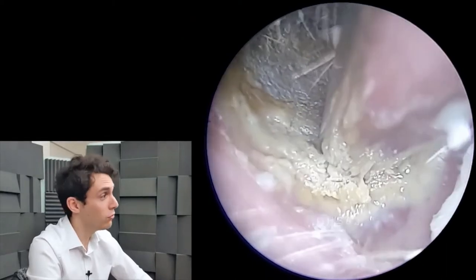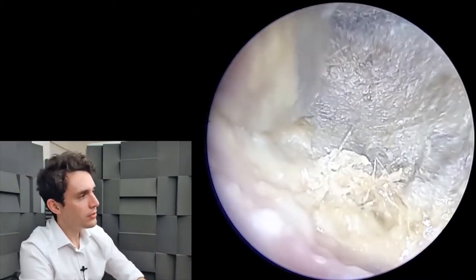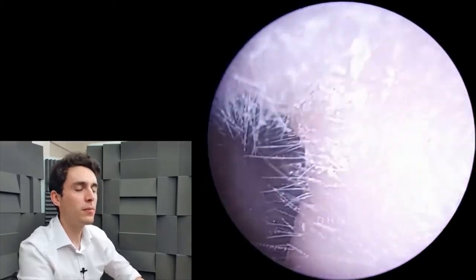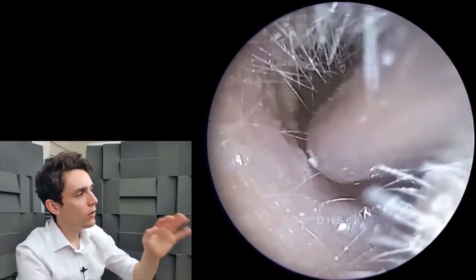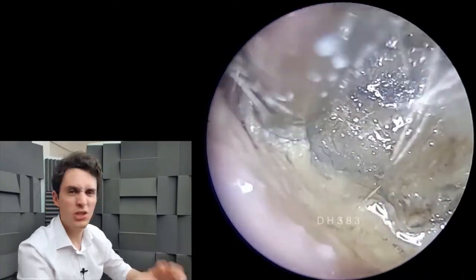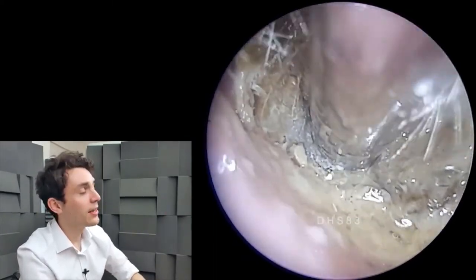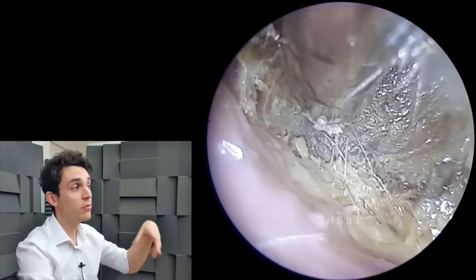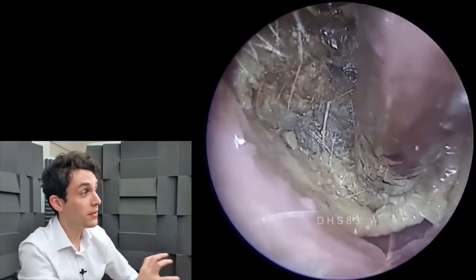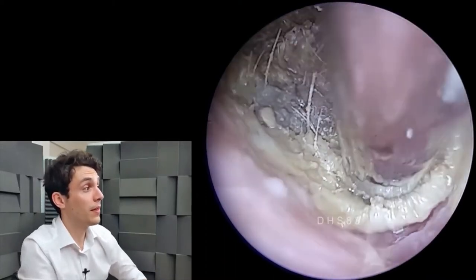I don't get very many cases of foreign bodies, marbles, and things like that. In this ear we have a very similar appearance — a very dense plug of dead skin which is suspiciously smooth and concave. I wonder what could have possibly made it smooth and concave like that. Either way, with olive oil I now have a lot more success with a standard steel suction probe — a Zoellner suction probe — and what I'm doing here is lifting off the sides. In fact, doing this process first probably makes use of the Clearway suction handle a lot safer.